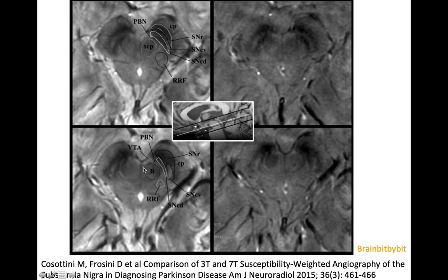On 7 tesla, at the lower midbrain level, you can also see hyperintense signal of the dopaminergic neurons of the ventral tegmental area, which connects to the limbic system.